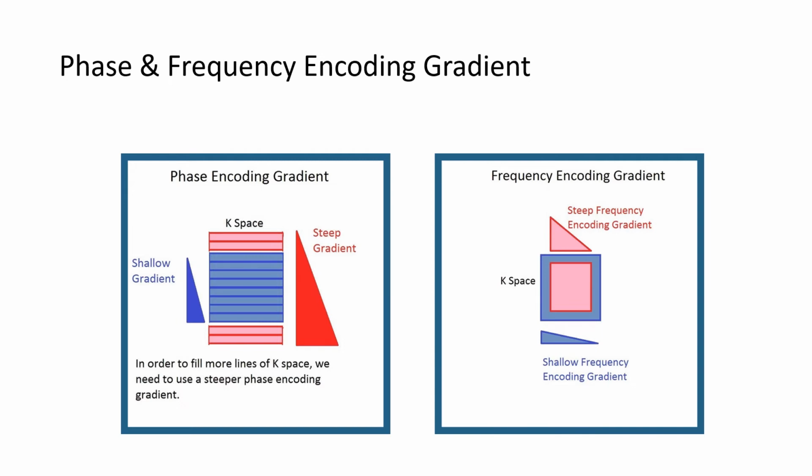Then we have a frequency encoding gradient. We shall activate the frequency encoding gradient at the echo time, TE. The slope of the frequency encoding gradient will have an effect on our picture as well. A reduced field of view will result from a greater gradient slope. It is vital to note that gradient activations are more intricate than what is covered in this chapter. This is sufficient for the purposes of MRI safety.